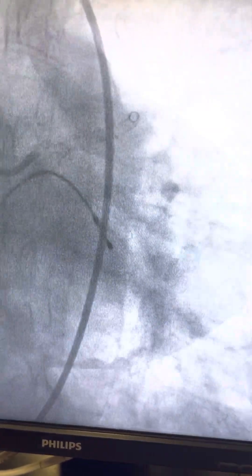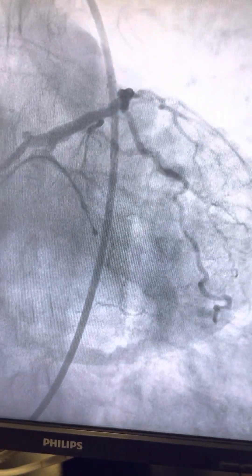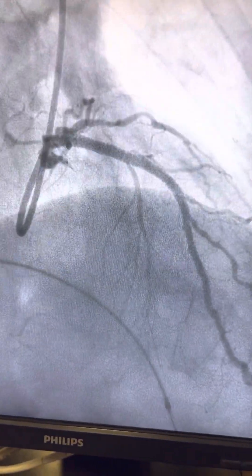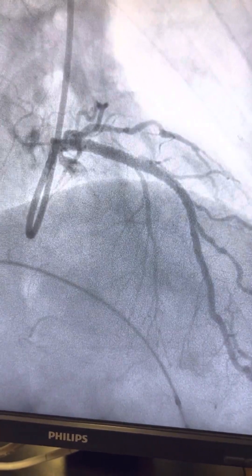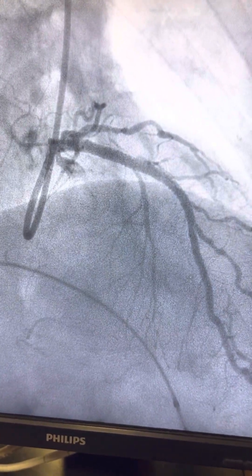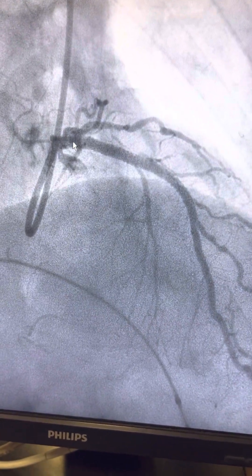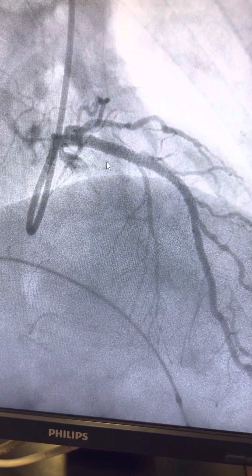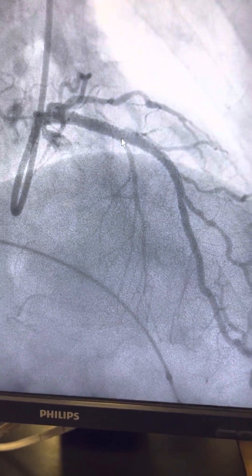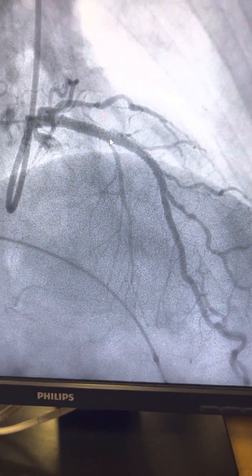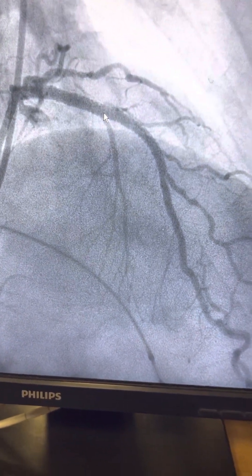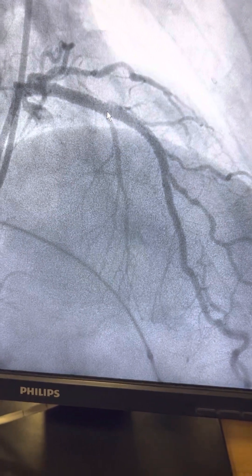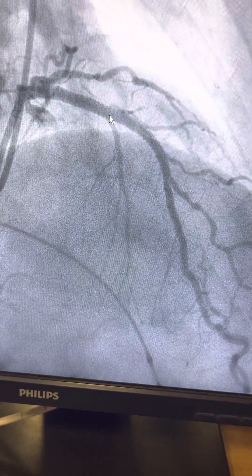These are the post-procedure views. This is the final result — you can see a good expanded left main. This is the left main portion which had 80% stenosis and this is the LAD lesion which had 90% stenosis. A nicely expanded stent with rotablation. Thank you.